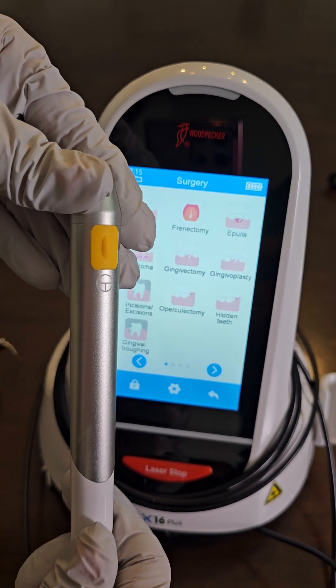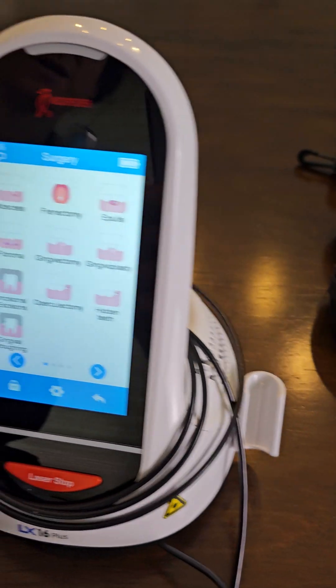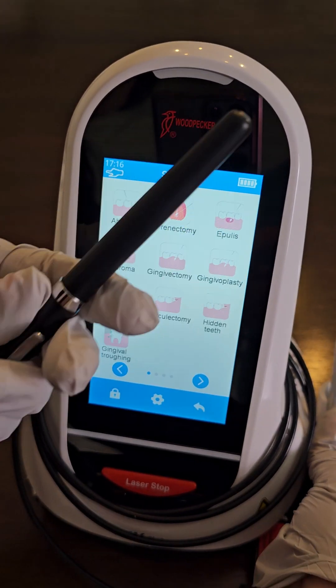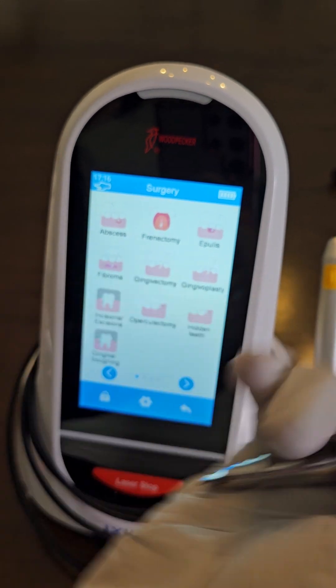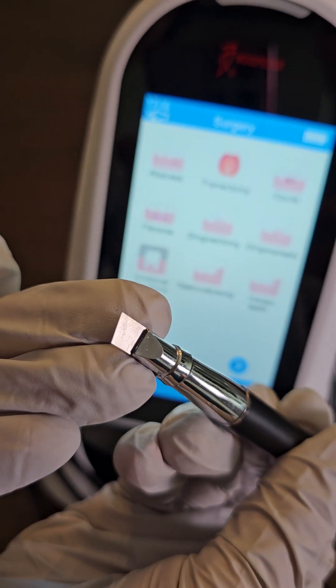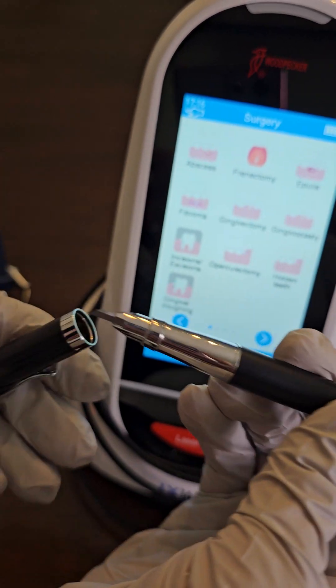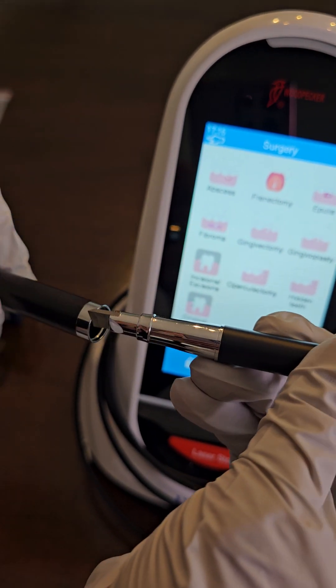Should you want to cleave your tip and it's too long, this is a cleaving unit. You open this up and there's a knife inside to cleave the tip. You can look at our stripping and cleaving video to see how to cleave a fiber tip.